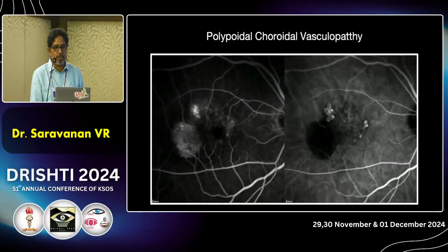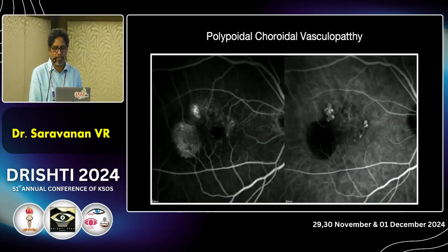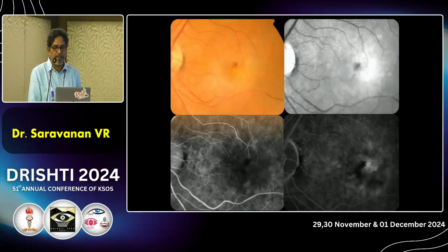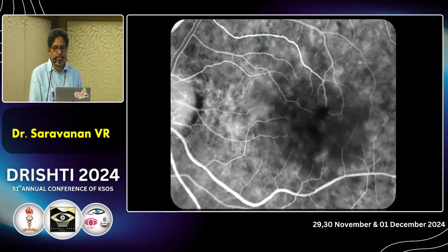And again, I'm showing examples of some cases where you will absolutely need a fluorescein angiogram or indocyanine green angiogram. So polypoidal choroidal vasculopathy, as I told you, because the branching vascular network and the polyps are easily picked up on ICG, and it's the gold standard. And for diagnosing RAP lesion, type 3 CNVM, you can see the right angle blood vessel dipping into the choroid and filling up the underneath network.